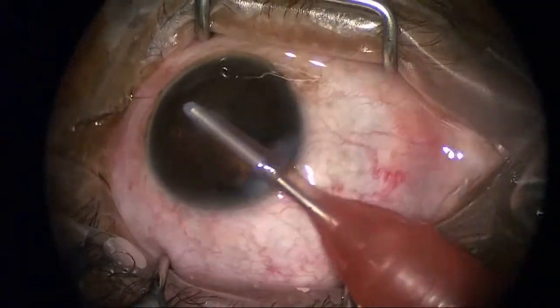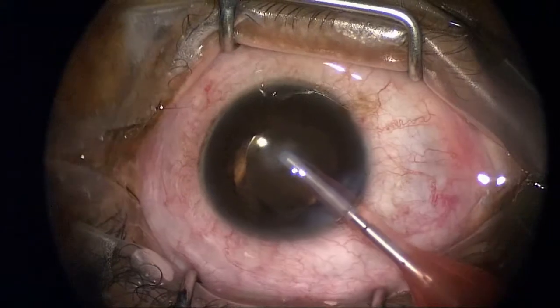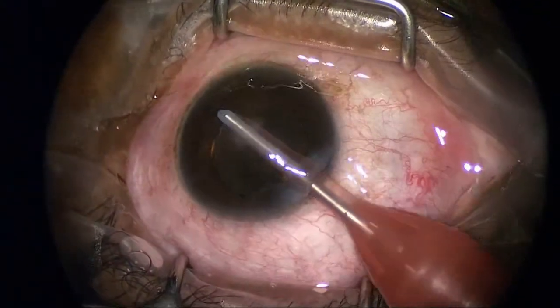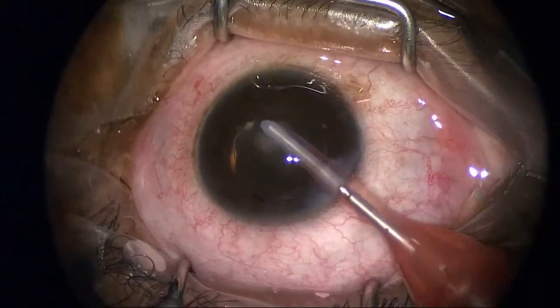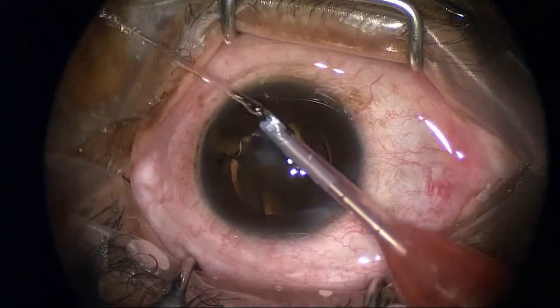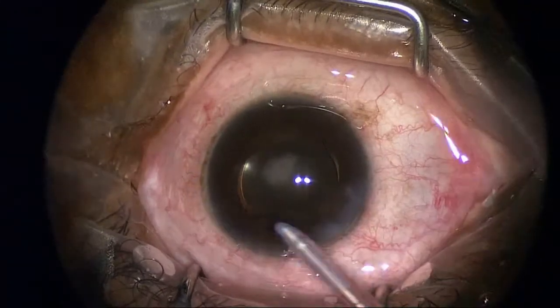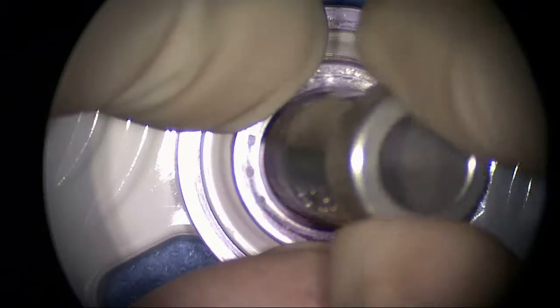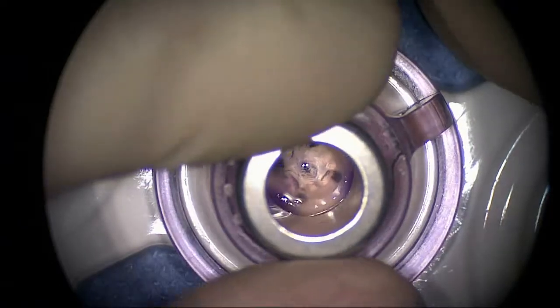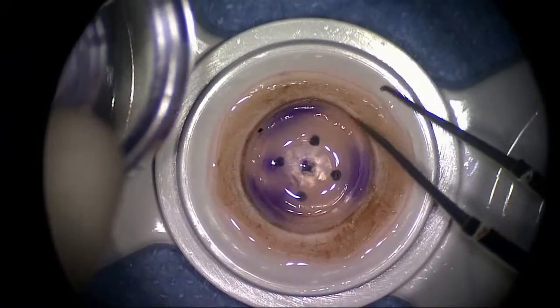I'm removing the cohesive viscoelastic and making sure that the intraocular lens implant is properly centered within the capsular bag. I'll go ahead and put an anterior chamber maintainer in — this is a low-flow anterior chamber maintainer. I properly center the donor tissue under the microscope and go ahead and cut it in preparation for insertion.